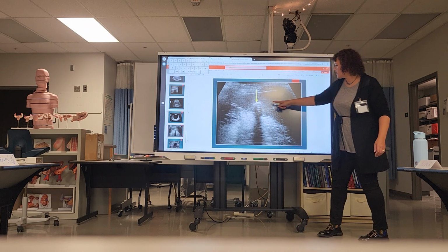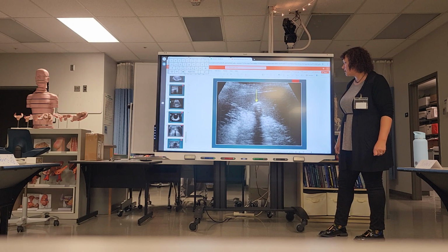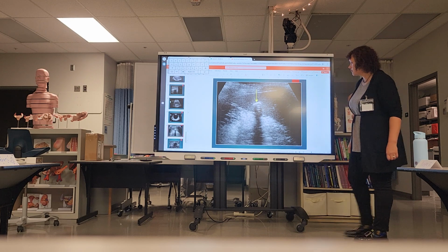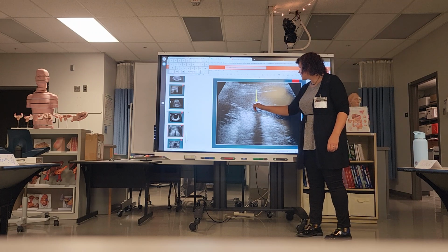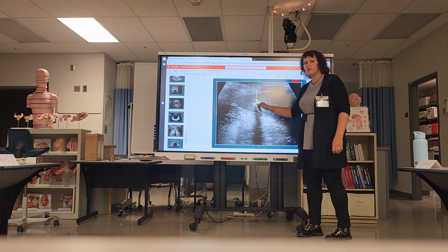All right, what's the echogenicity of this right here? Hyperechoic. Hyperechoic or echogenic? And how would you define these borders? Nice, where that shadowing is. Yeah, definitely irregular. It's not smooth, but we could put calipers on there, for sure.